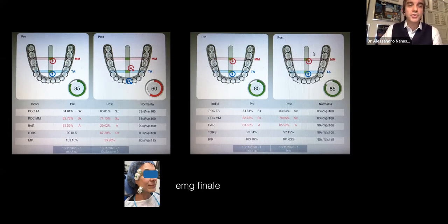Okay, I'm sure my mock-up is correct, so I can prepare an occlusal treatment plan for the patient to modify his occlusion. And you can see with this red ring with 60% of symmetry and a bad occlusion of the patient, a bad intercuspation. The load is all anterior with torsion to the left side of the patient, is not perfect.